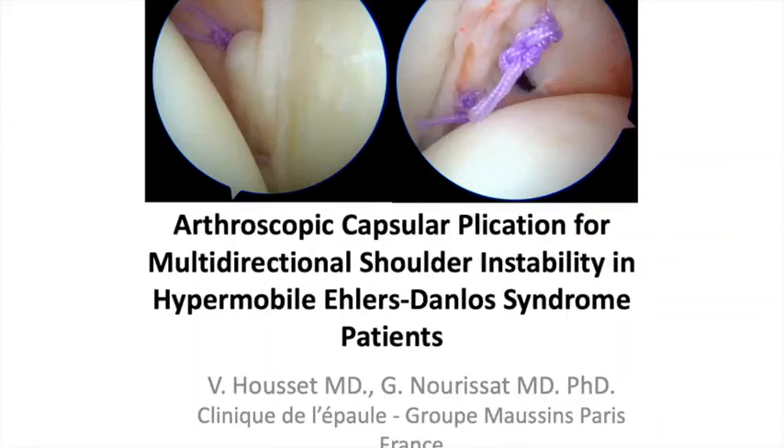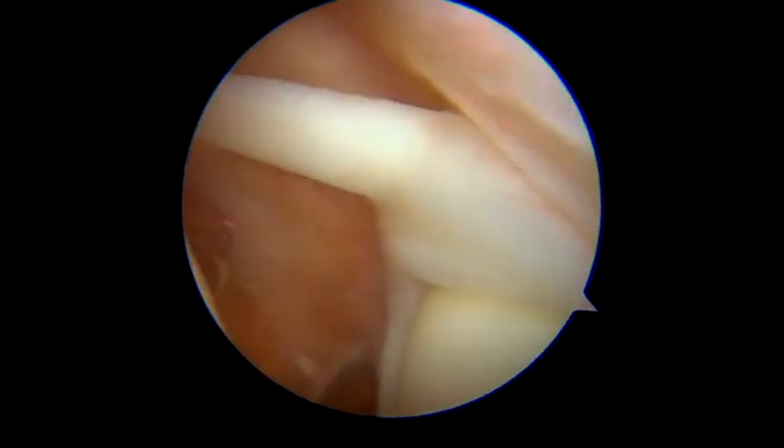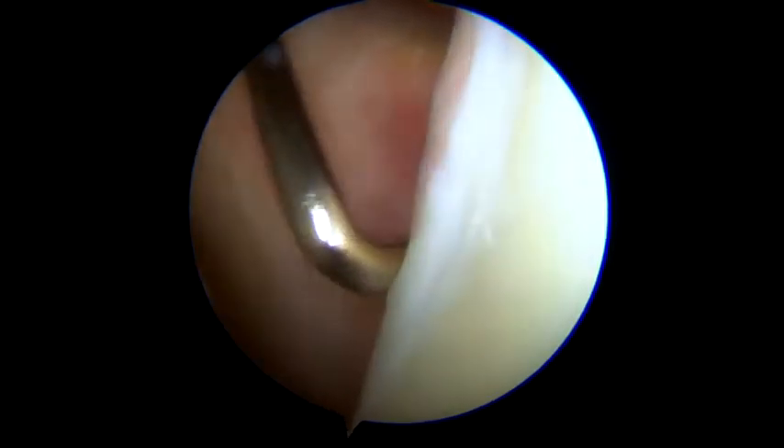We introduce the arthroscopic capsule plication for multidirectional shoulder instability in hypermobile Ehlers-Danlos syndrome patients. Multidirectional shoulder instability, considered poorly described, does not yet have a precise definition. However, it is common to observe in the Ehlers-Danlos syndrome patient, as in multidirectional instability patients, a patulous and loose joint capsule, as well as a labral complex that seems ineffective and incongruent during the first exploratory phase of the arthroscopic procedure.